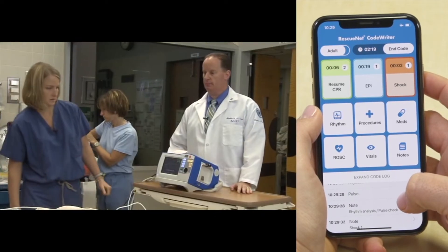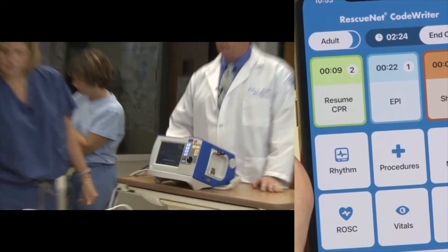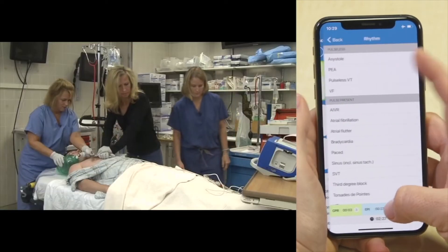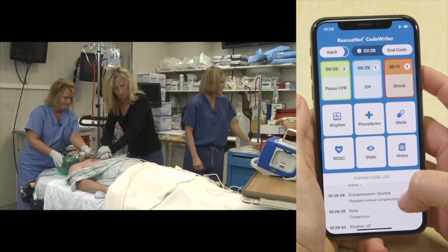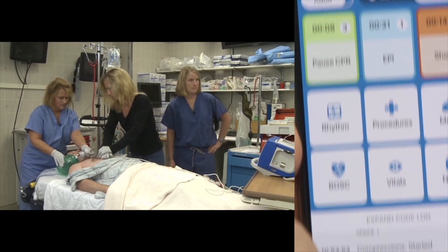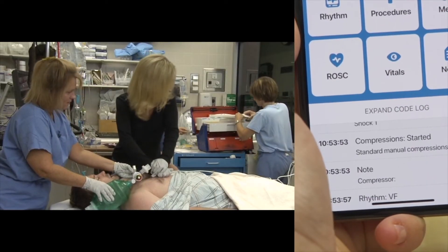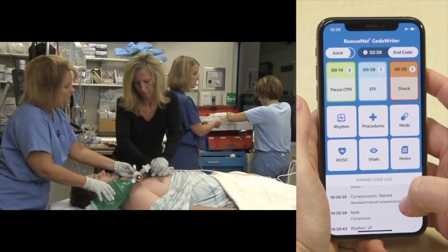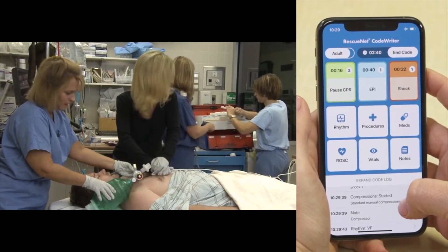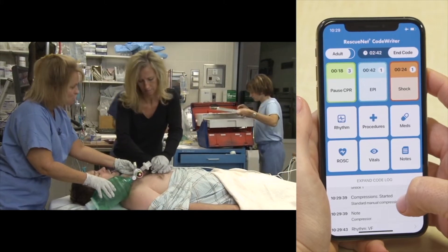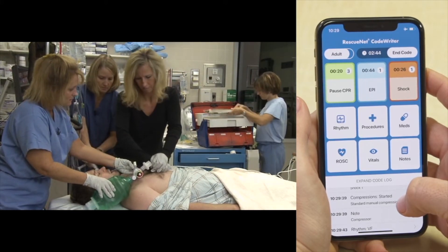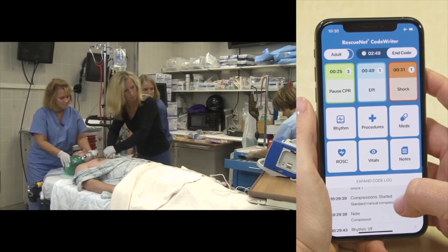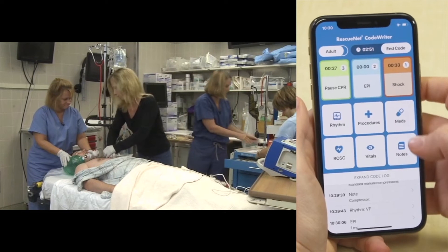CPR resumes after the first shock. A second round of epinephrine is ordered after two minutes and magnesium is also given. The patient is easy to bag with good compliance. A blood pressure and pulse are felt. The second epi is confirmed as given. The team prepares for a second defibrillation attempt.